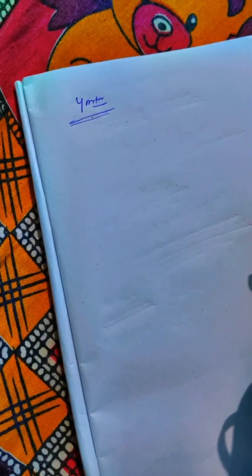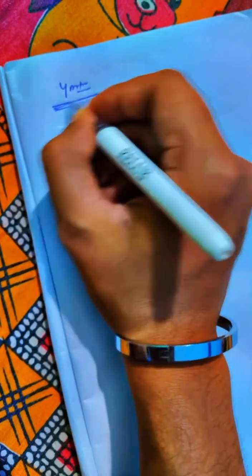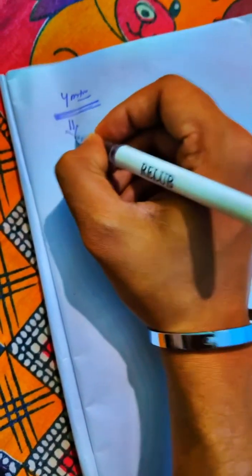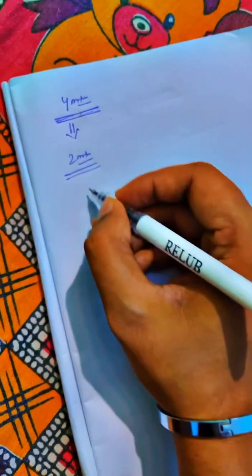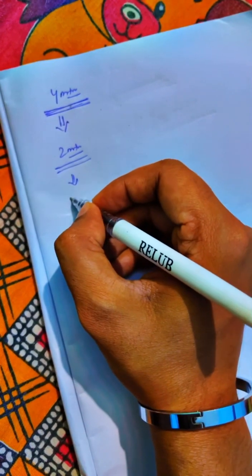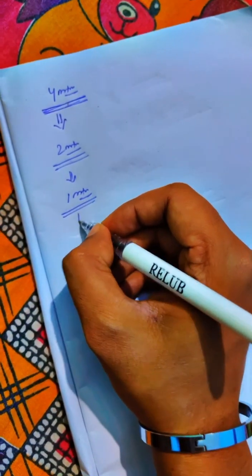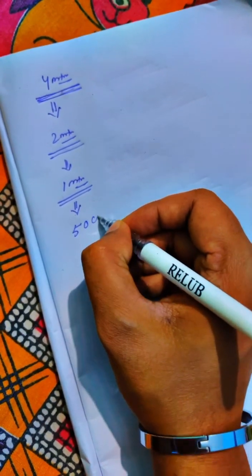Got it? So the next thing is, if a person cannot read the first line of a LogMAR chart at 4 meter, what do we have to do next? We have to reduce the distance to 2 meter. If the person cannot read at 2 meter also, we reduce the distance to 1 meter. If the person still cannot read at 1 meter, then we reduce to 50 centimeter.